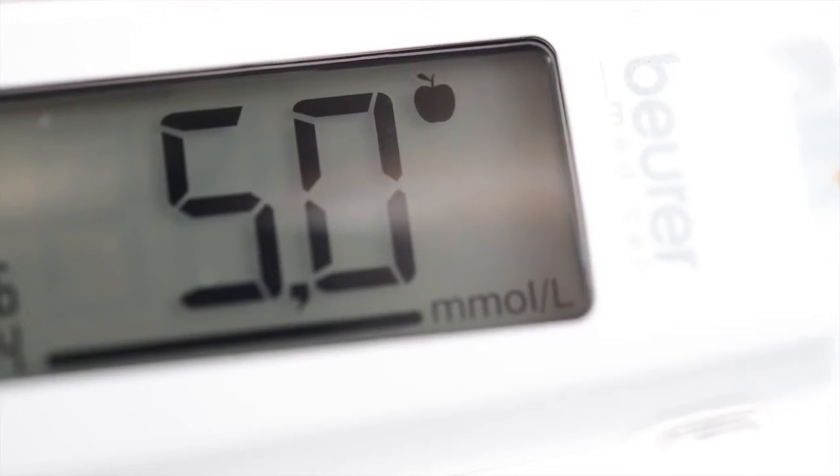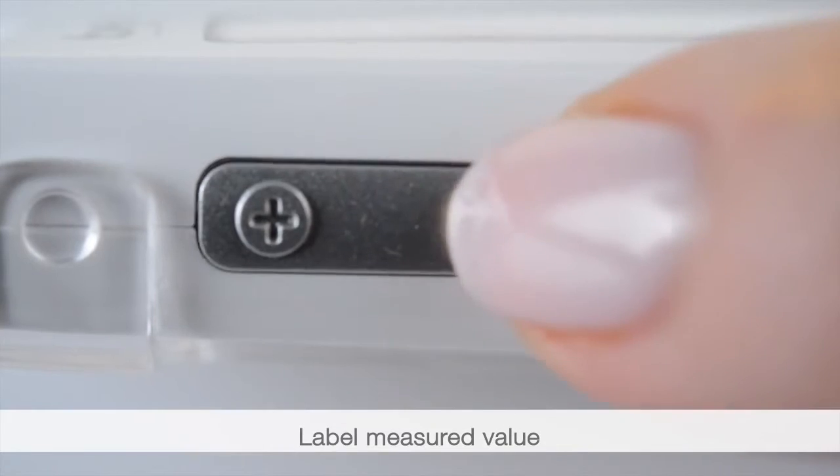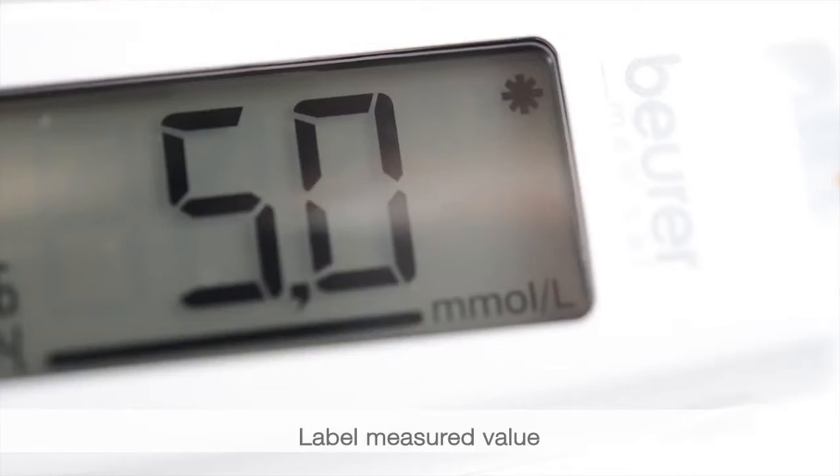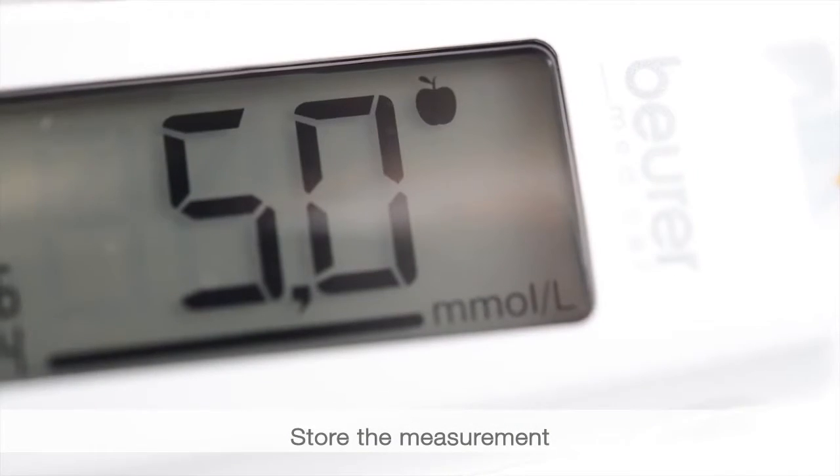For a measurement before a meal, press minus once. For a measurement after a meal, press minus twice. For general labelling, press the minus button three times.